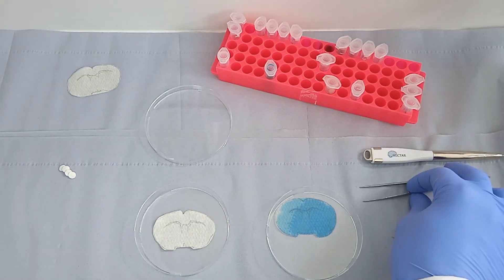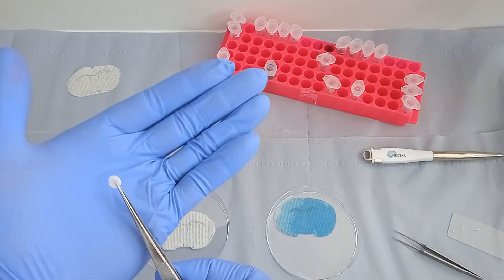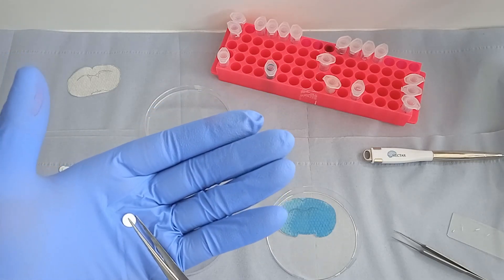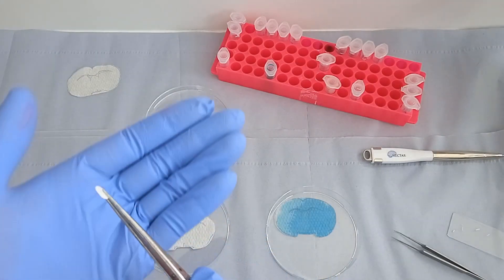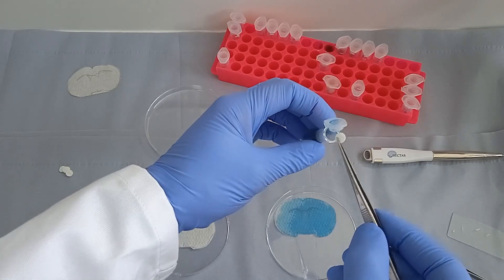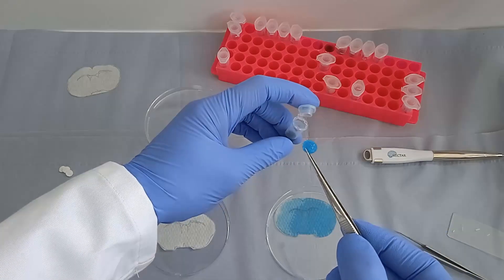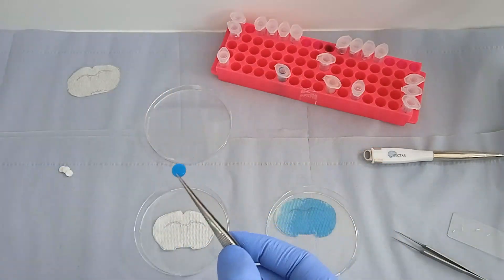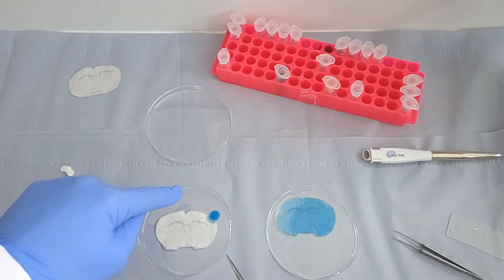What I'm demonstrating now is the cryogel biomaterials. I'm picking one up — this can be picked up with a pair of tweezers. Again, this one's much larger than we would typically use in slice culture. These can be dipped into reagent and because they're highly porous, they will soak it up like a sponge. As you pull it out, it's larger than it was when it went in — it soaked up the food colouring — and that can be placed right next to the tissue slice to create a regional effect.